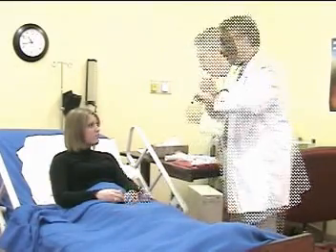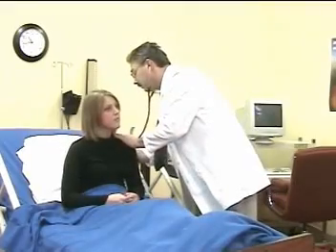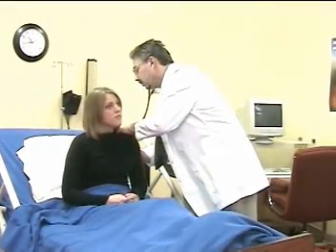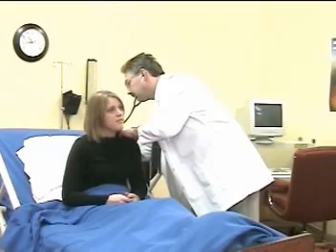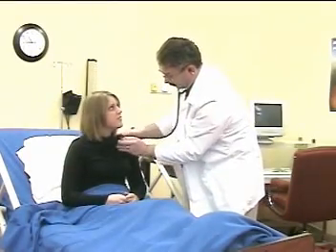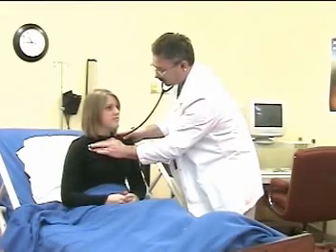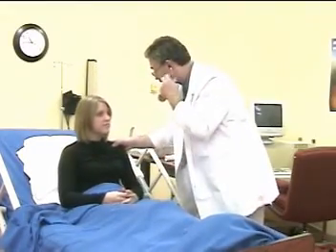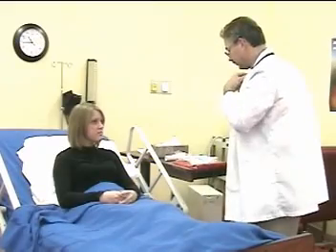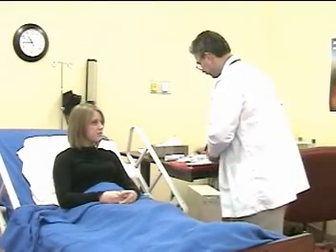To listen to your lungs, I'm going to have you lean forward. Nice big breath in. You must be feeling tight right now. Lean back. The therapist monitors the patient's pulse, respiratory rate, breath sounds, and peak flow rate.